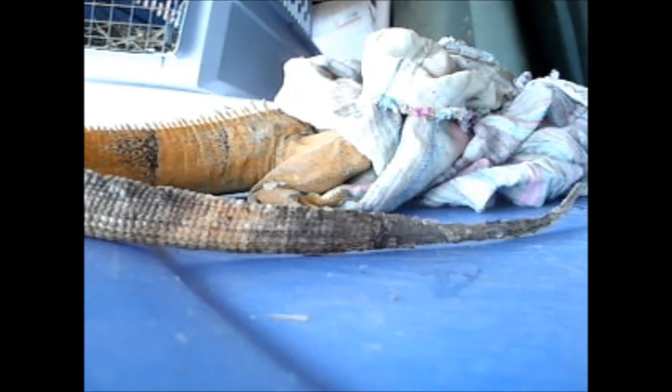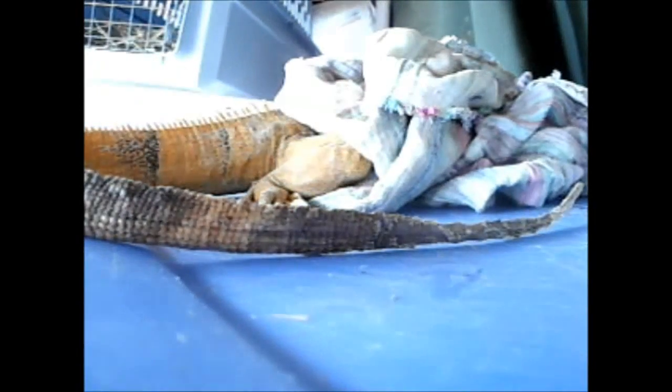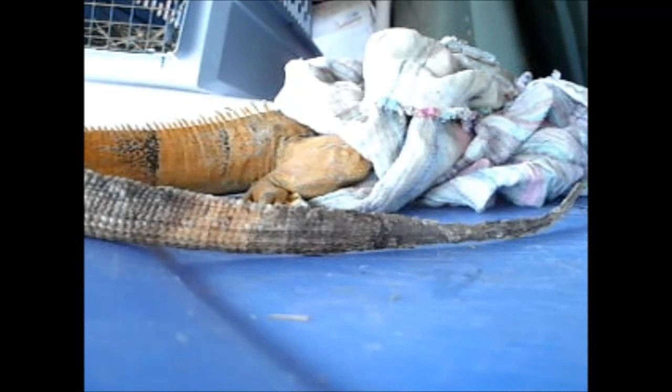And some may ask, you know, why you don't use general anesthesia for something like this. And of course, that would reduce his pain even more if he was out for it. But also, that's a really big risk for what is a relatively minor procedure. So there's always a risk given a general anesthetic to animal or person that they're going to stop breathing and, you know, they're just not going to wake up. So that's a pretty big risk just for removing the end of a tail, which can be accomplished with a local anesthetic. So that's why we're doing it this way.